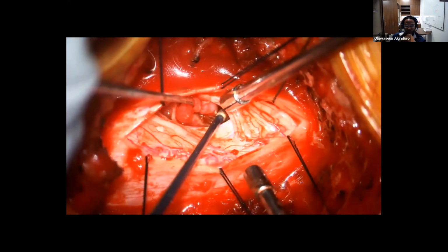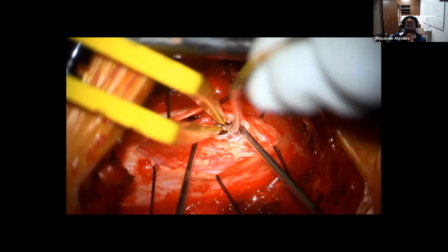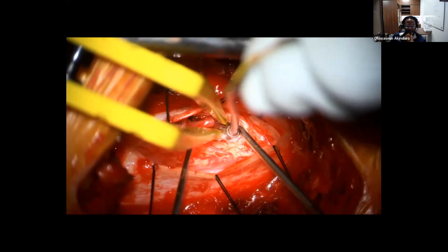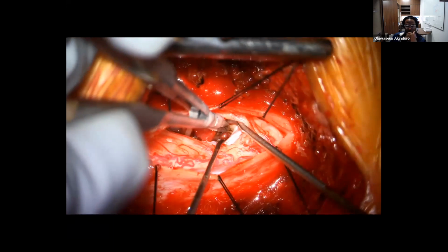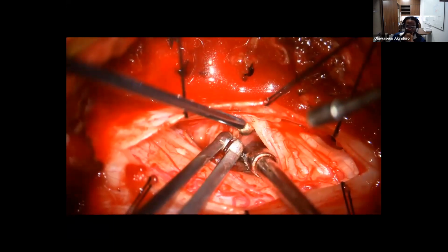So there, you can see that we found where it was attached, and it was attached by a nerve root. So obviously pointing to a schwannoma. So you saw how you always want to stimulate the nerve first.